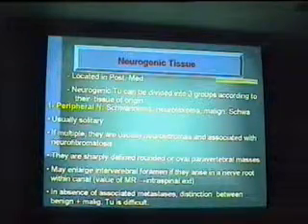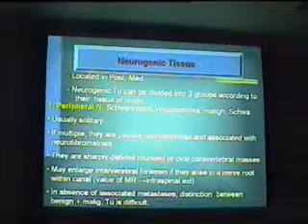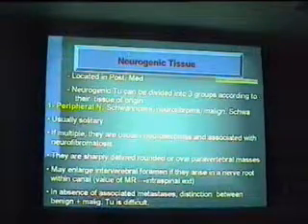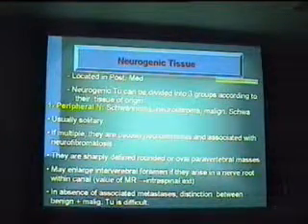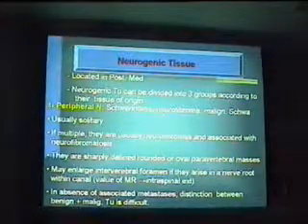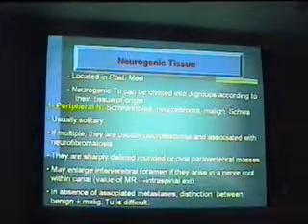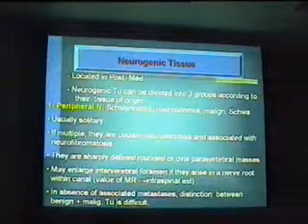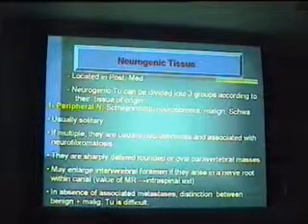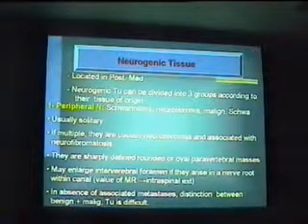وطبعا هنا الـ MR بيبقى له value قوي عشان بلاقي site of origin إنه طالع intraspinal. In absence of associated metastasis, distinction between benign and malignant tumor is difficult. يعني إيه؟ يعني it's very hard to differentiate between neuro schwannoma مثلا والـ malignant schwannoma أو neurofibroma و neurofibrosarcoma. It's very hard. الاتنين ممكن يحصل فيهم breaking down، يعني breaking down ما يرجحش إن دي مثلا malignant tumor. Okay? Unless we have metastasis مش هقدر أشخص دي benign ولا malignant. Unless عندي مثلا destruction في الفرتبرا اللي جنبها مش هقدر أشخص إن دي benign ولا malignant. Okay?